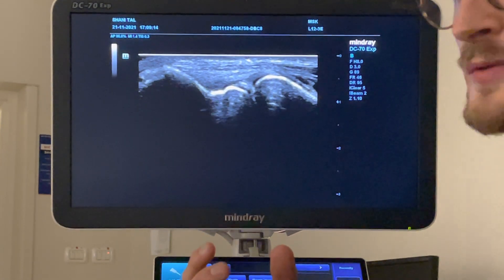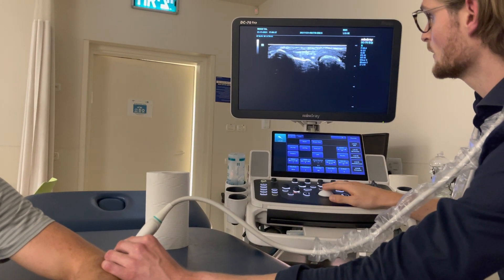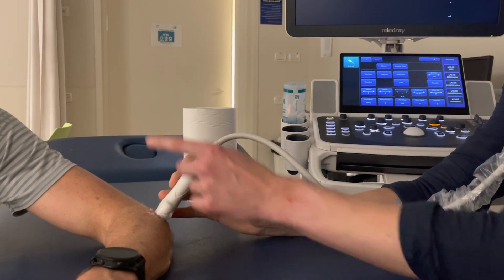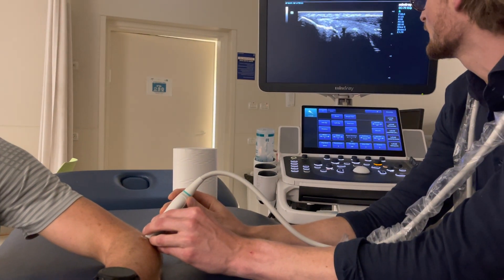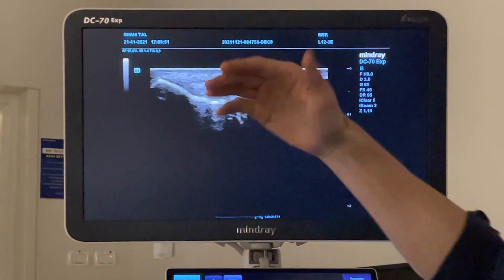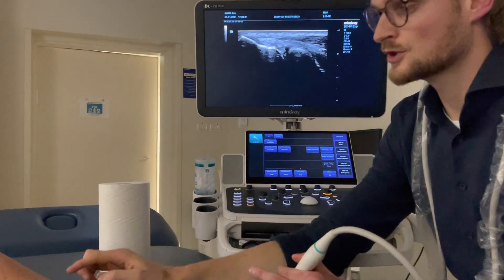This middle layer is composed of extensor digiti minimi and also the extensor carpi radialis brevis, and on top you can see it really clearly — this more or less hypoechoic region that is the extensor digitorum communis. So these are the three layers for the common extensor tendon. But we want to isolate the brevis more, so if we go up a little bit towards the shoulder we can isolate the brevis more. I go up, I lose a little bit the curvy appearance. There's the radial head, and then to make a perfect image, the distal side of the probe is moving more upwards than the proximal part. This is the perfect example of the brevis here, with the longus on top.